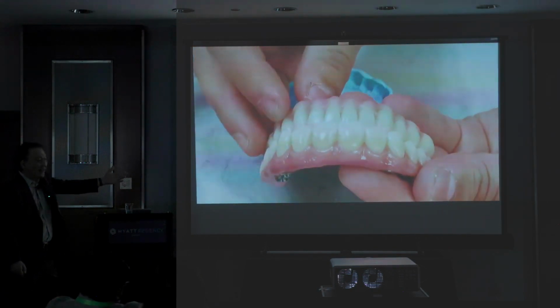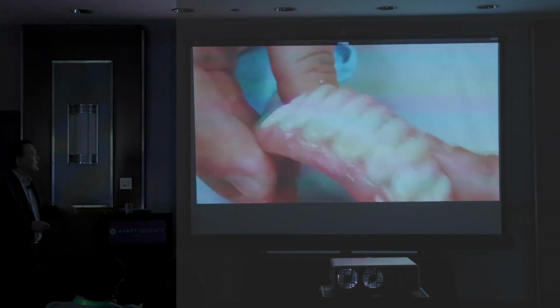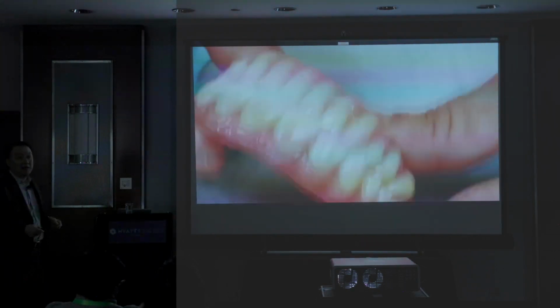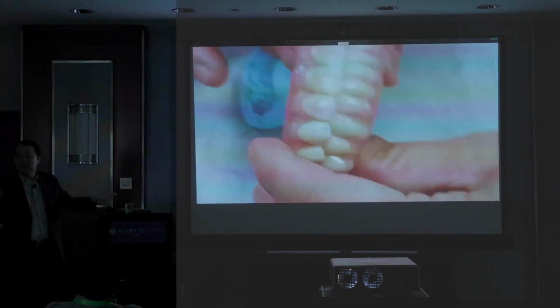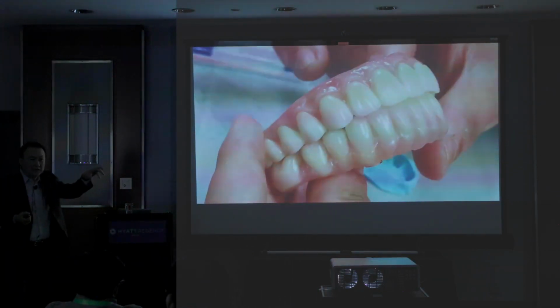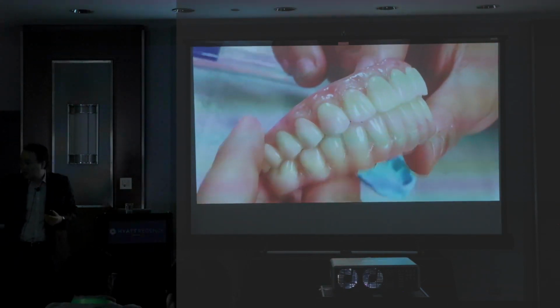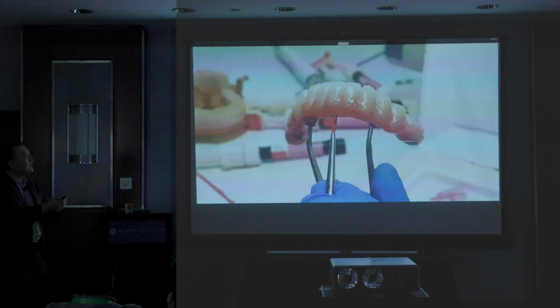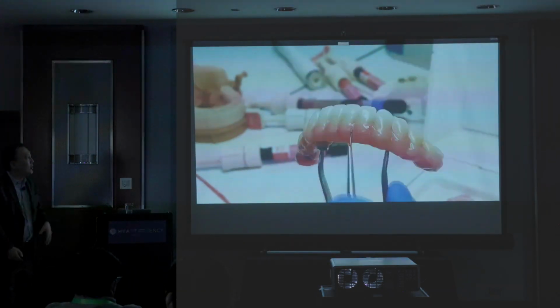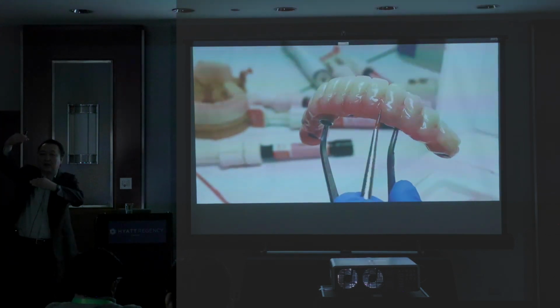Here's another trick. How can you match the zirconia to a composite tissue color? It's different. Why? It's two different materials we're talking about. Ceramic, you have to bake. Composite denture, you cure and process. So two different. So here is what we do: make it thicker using the gradient, and then try to match it off.